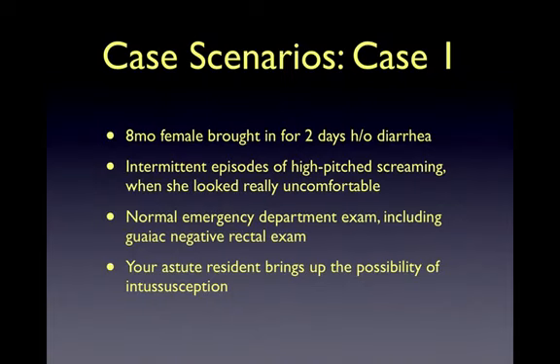Your astute resident brings up the possibility of intussusception, but your clinical suspicion is not really high given the history mentioned. Now you're just looking for a quick way to end this visit, and bedside ultrasound is your answer there.